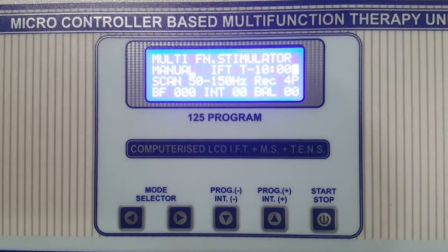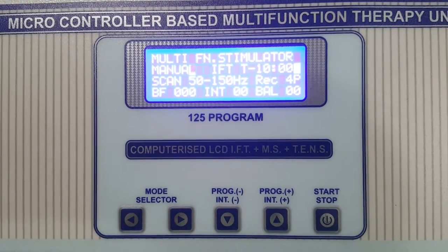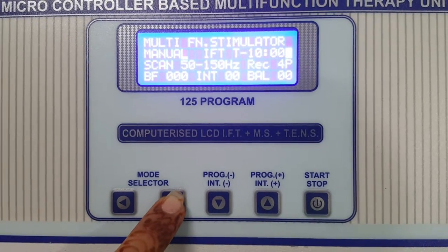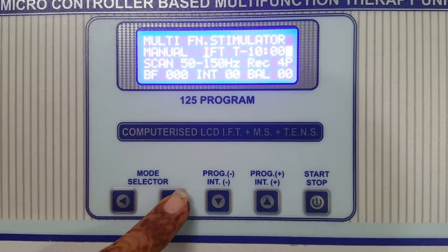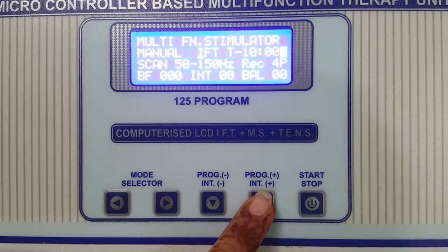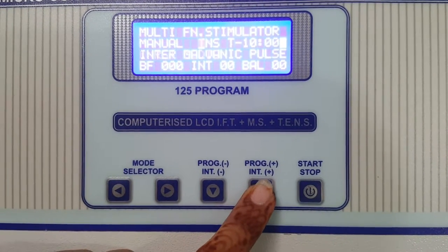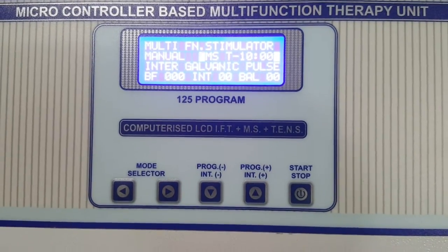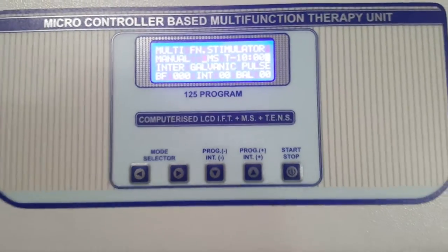If you want to set the parameters — IFT, Russian, Muscle Stimulator, or TENS — you can select from here. Move the cursor and then select the mode: IFT, Russian, TENS, or Muscle Stimulator. You can further check the parameters accordingly. The demo is completed.